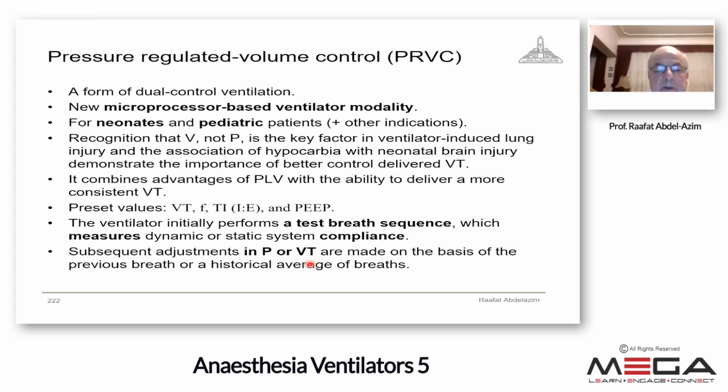Recognition that the volume, not the pressure, is the key factor in ventilation-induced lung injury leads to development of this mode. It combines advantages of pressure-limited ventilation with the ability to deliver more constant tidal volume. As I said, with pressure limitation and pressure controlled ventilation, there will be changes in the tidal volume by increase or decrease in the patient's compliance and resistance. To avoid these changes, the pressure regulated volume control is used.